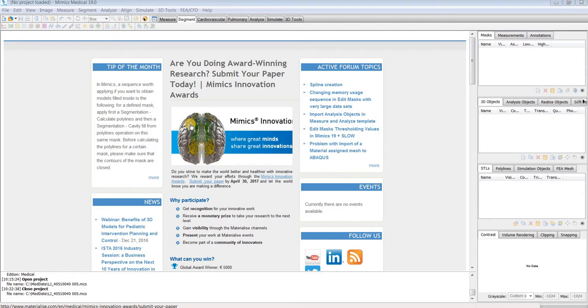Hello, in this video I will give a brief introduction to Mimix to help you get started with the software.